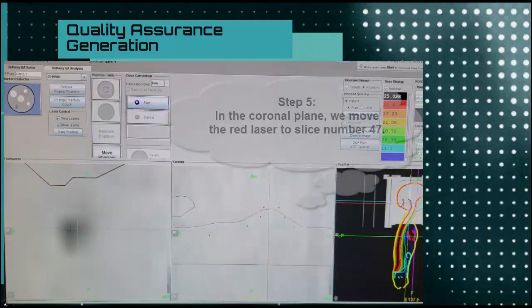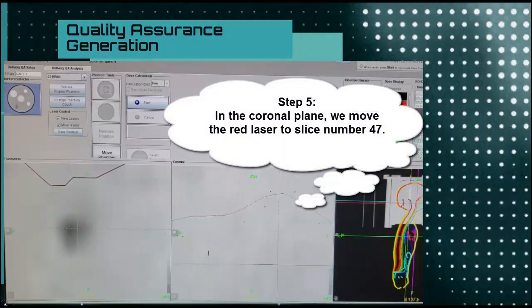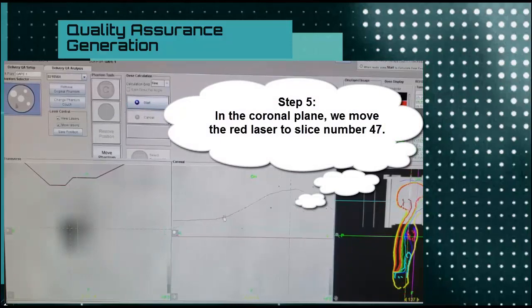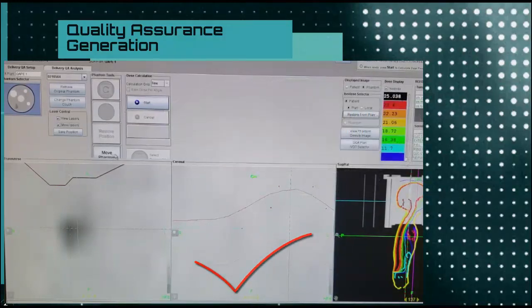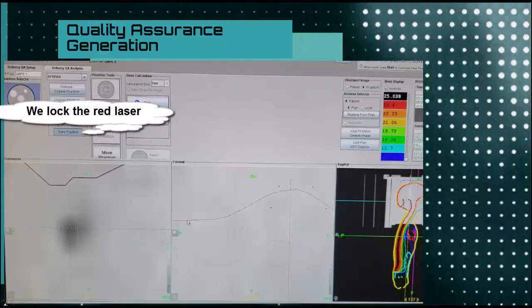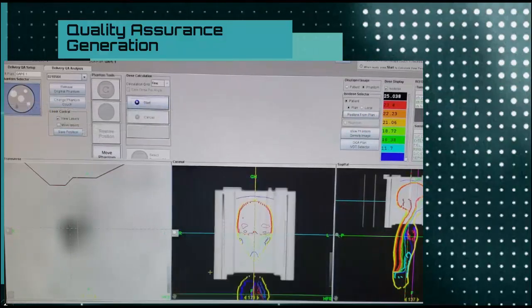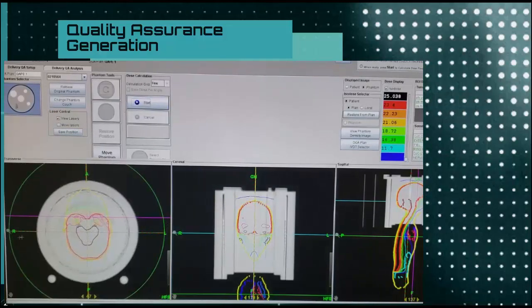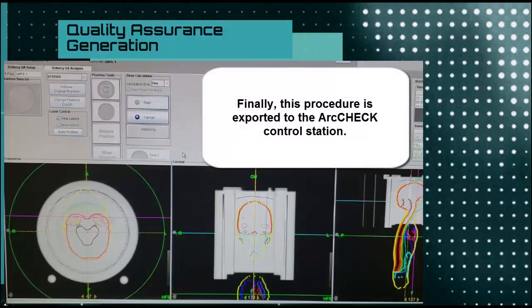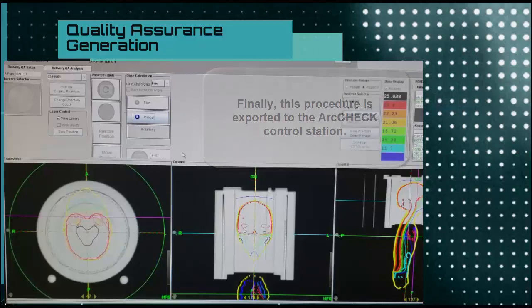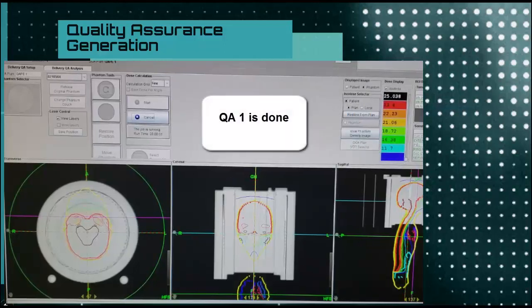On the coronal plane, we'll place the red lasers on the tomograph slice we're looking at on the transversal plane. It's important to use zoom as a tool. Once that's done, we place our red lasers and the system calculates the dose distribution. After finalizing calculations, we export this procedure to the arc check computer and we have Quality Assurance Procedure 1 done.